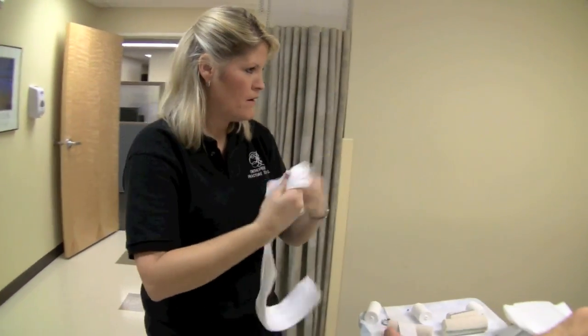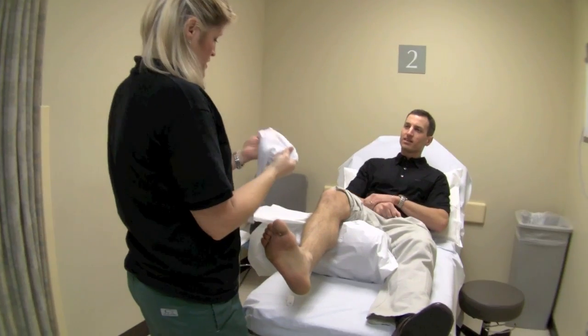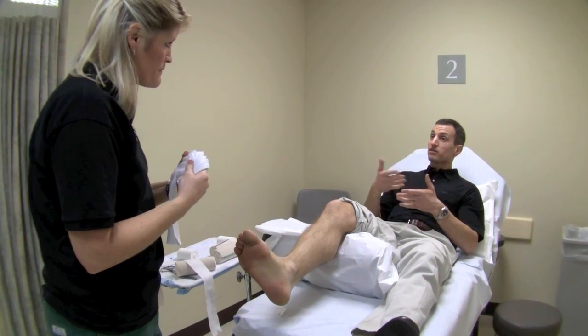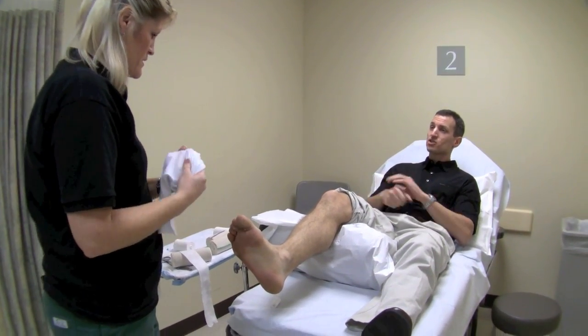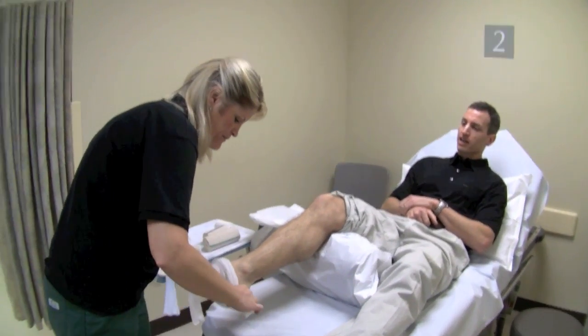The first thing going on is this sock-like thing called a stockinette. We're using the stockinette to protect the skin from sweating and keep it nice and clean. So the first step is the stockinette.